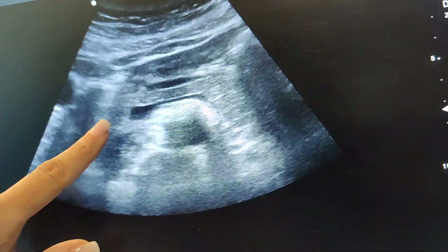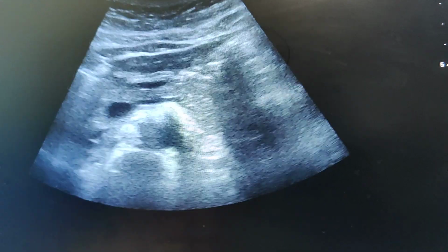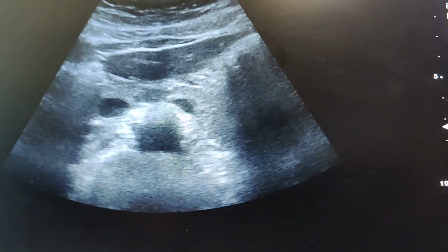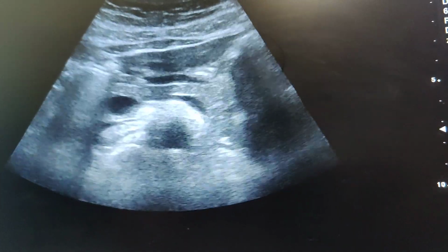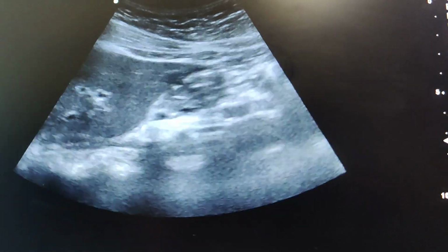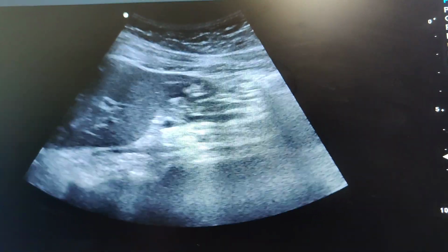So this is the pancreatic head. We see the body here and the tail right here. It's better if the patient's fasting for pancreas, but that doesn't always happen. The important thing for a lot of patients is the pancreatic head.